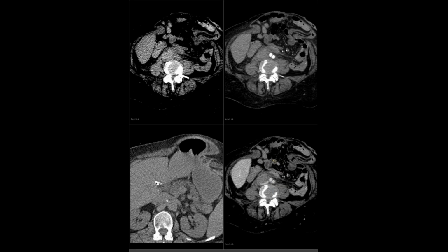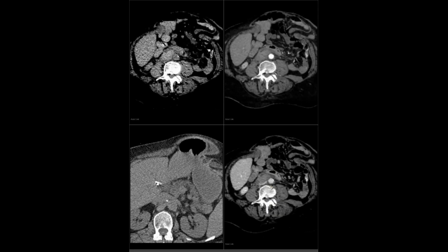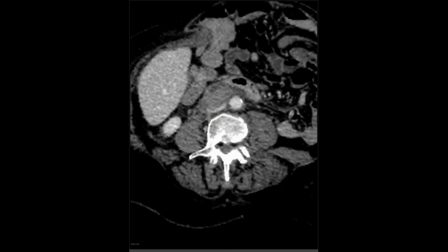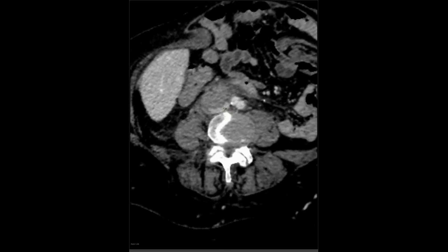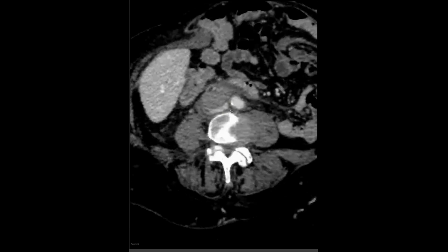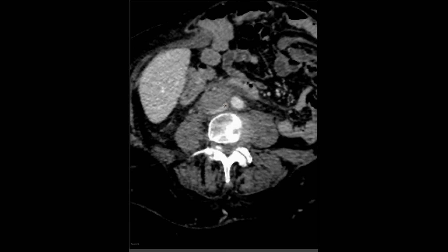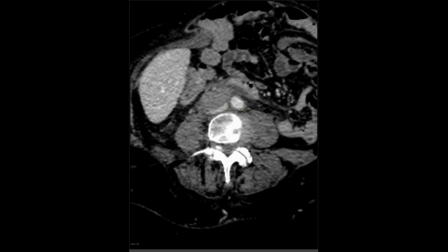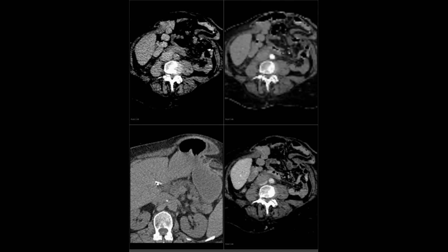No, I mean, is the wall tough enough to hold a hematoma like that? I've not seen that. Yeah, I don't know. You can see here's the residual IVC for sure, confined. I asked one of my IR colleagues, and he said he thought they probably do these all the time when they're doing angioplasties of the SVC and IVC. And then I found a case report of one from trauma, but this was a spontaneous event. Interesting.